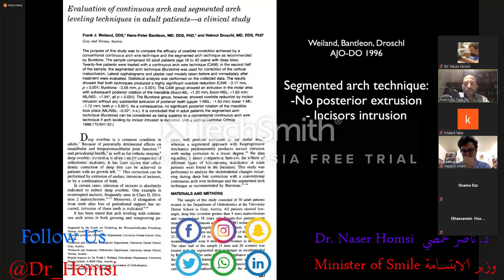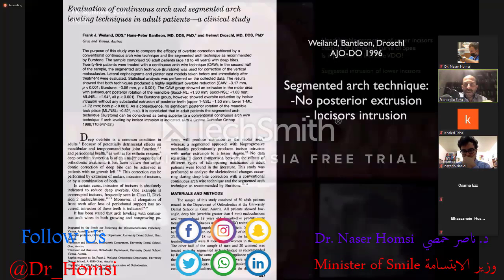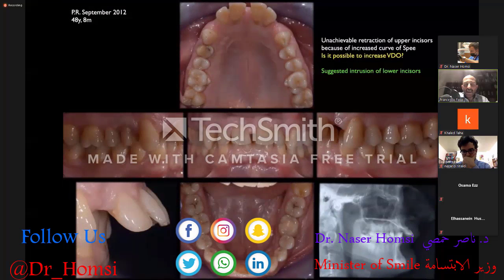This is the reason why we decided in Paulo's case to start by intruding the lower incisors.